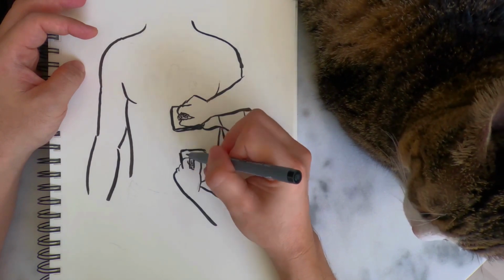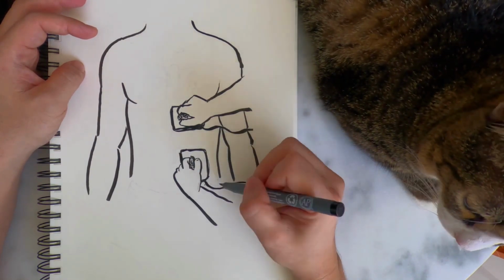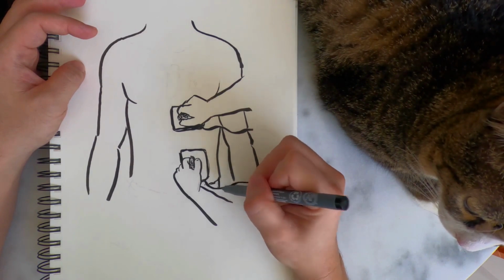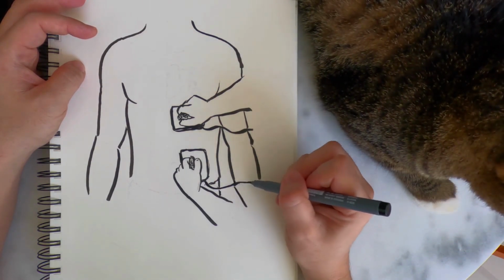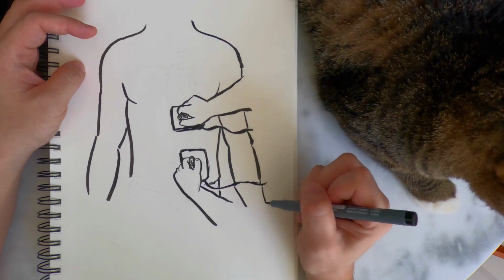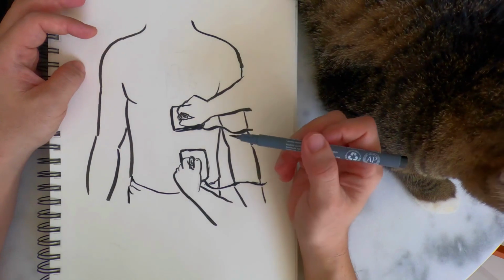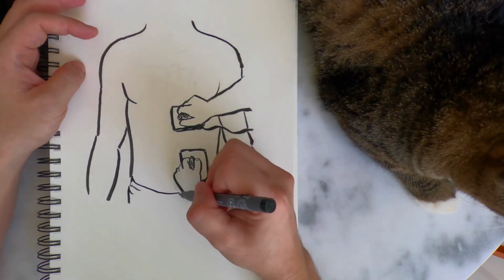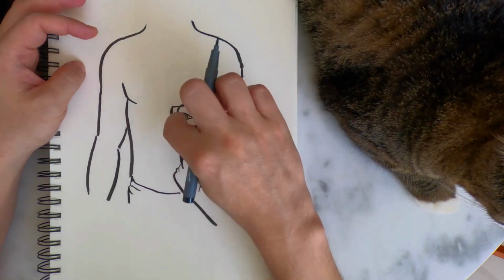There may be a feeling that if we encounter a situation where a patient has a wound, such as a large laceration on the right side of the head, we should be cautious. For instance, if we place another pad on the right side of the chest, just below the collarbone, we might worry that if the patient has a significant wound there, like a large tear with bleeding, and the heart has stopped, we could face issues.